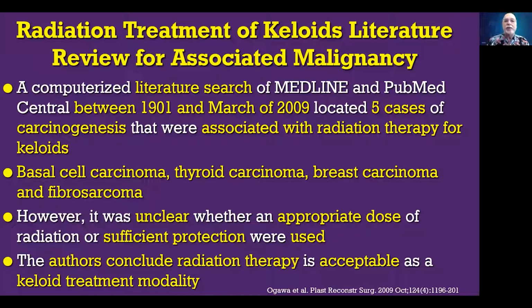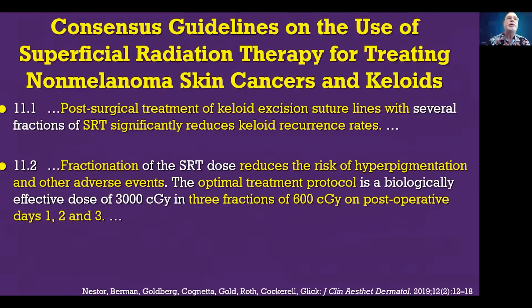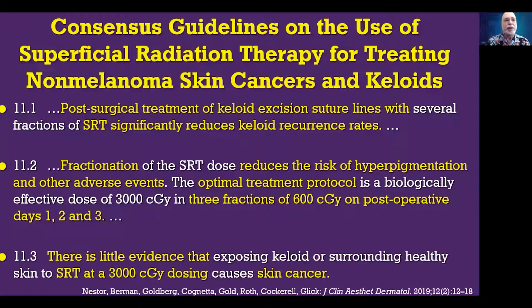The authors then concluded that radiation therapy is an acceptable modality for treatment of keloids, and this allowed for consensus guidelines to be developed regarding using the BED 30 on postoperative days 1, 2, and 3, fractionated at 6 gray, for the treatment of post-excision keloids. And they also noted that there was little evidence that exposing keloids or the surrounding healthy skin to SRT at the BED 30 causes any skin cancer.